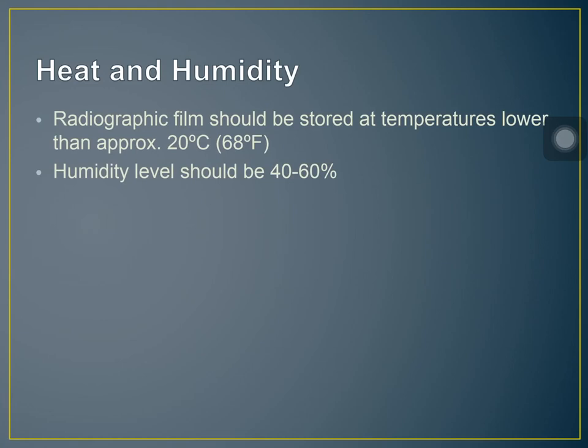If I'm not mistaken, it's either crown or tree. But I'm sure it's not smudge static artifact. Because static artifacts can come from handling of the film, and also from the humidity, and also from placing the box of the film horizontally.